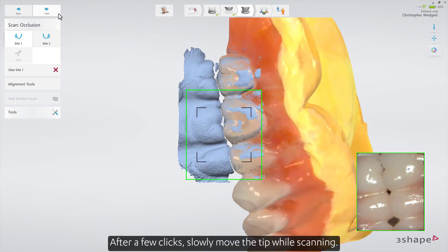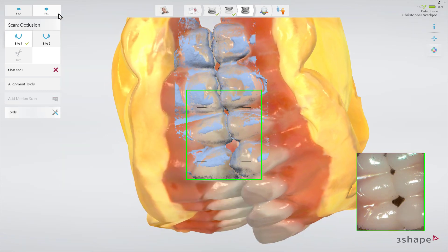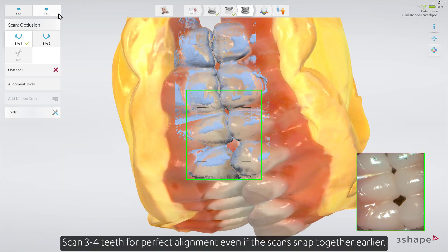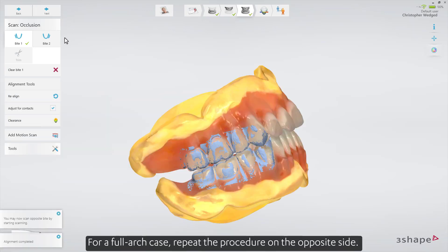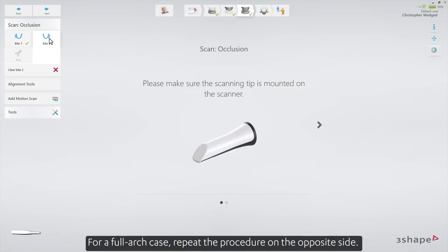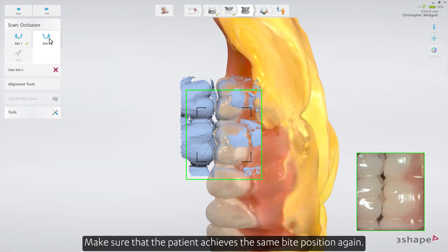Ask the patient to bite or set the construction bite. After a few clicks, slowly move the tip while scanning. Keep scanning until both arches snap into position. Scan three to four teeth for perfect alignment, even if the scans snapped together earlier. For a full arch case, repeat the procedure on the opposite side. Make sure that the patient achieves the same bite position again.